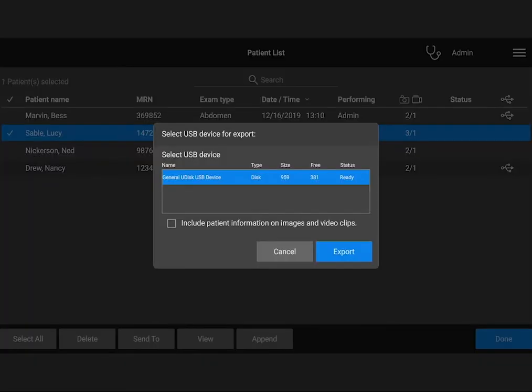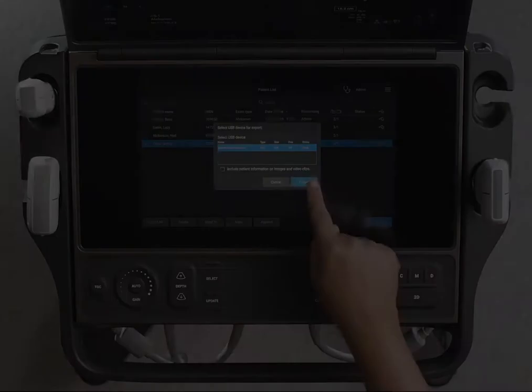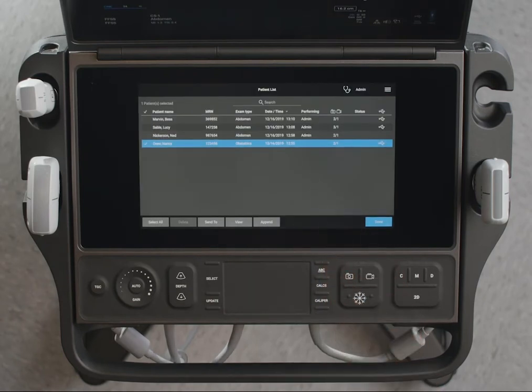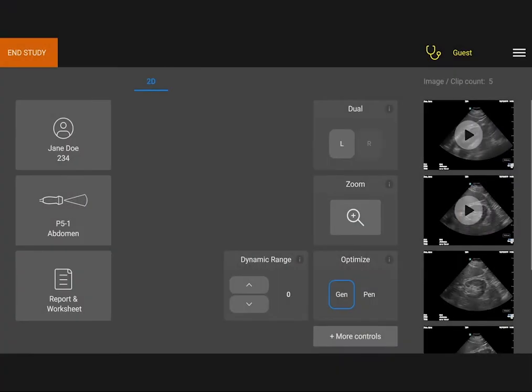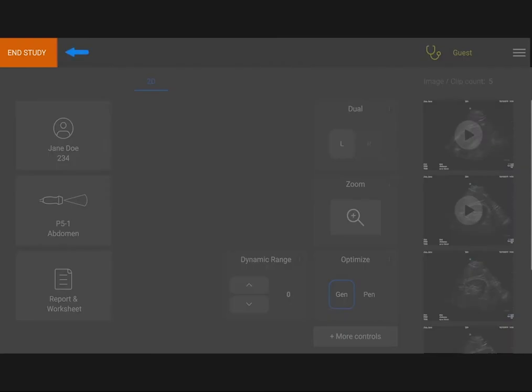On the bottom of the screen, you will see a notification that the export is in progress. Please note that you can't export an open exam. You must end it first.